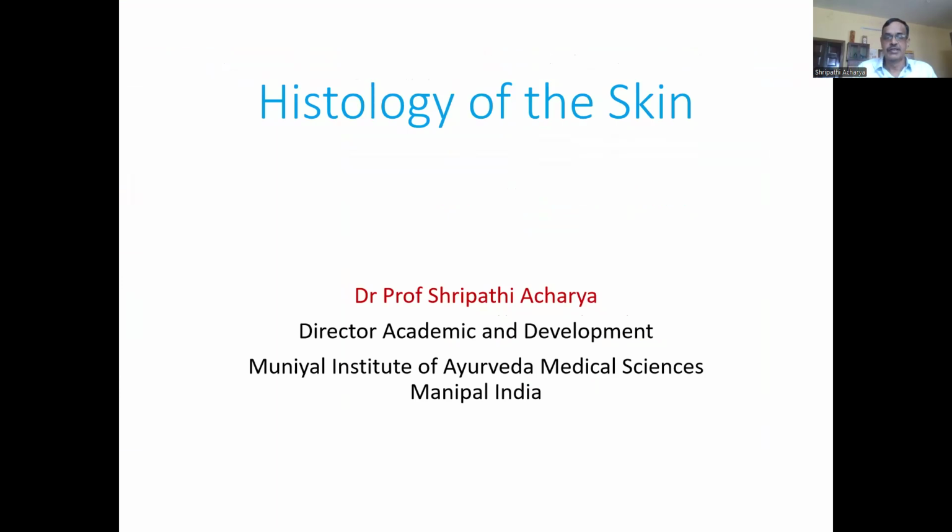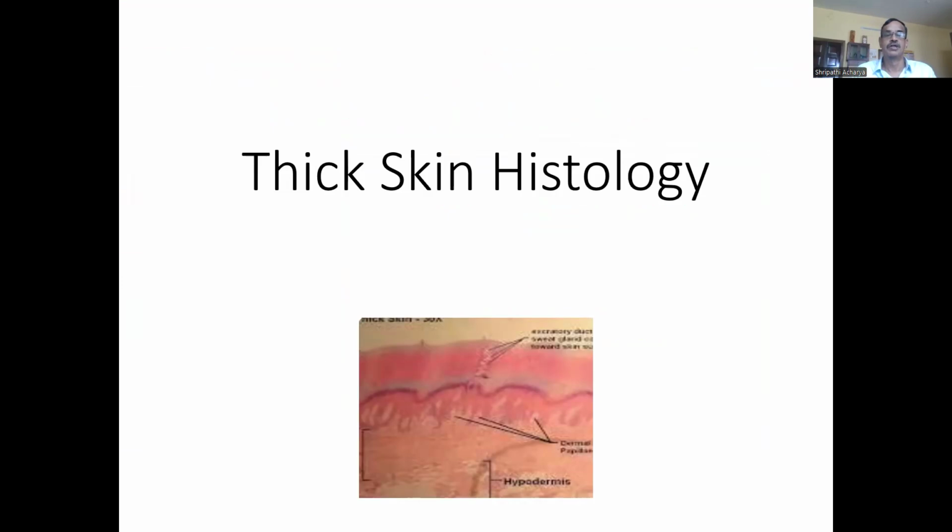Histology of the skin. First, let us see thick skin histology.